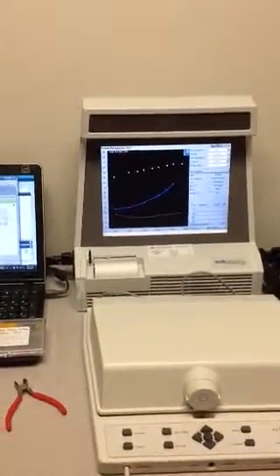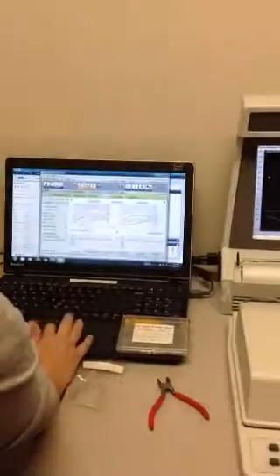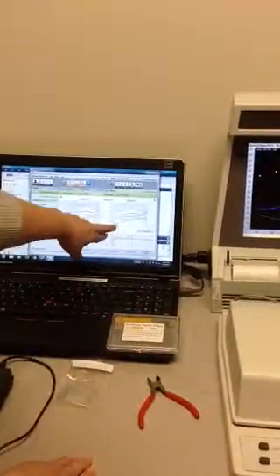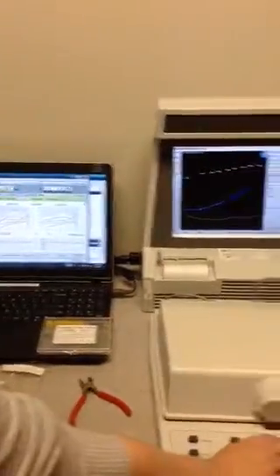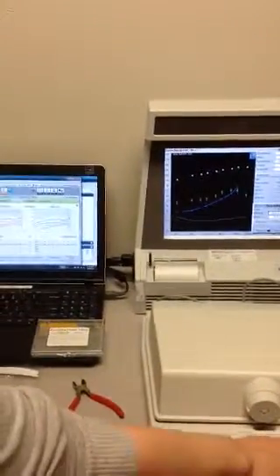Okay, so got ourselves connected here. Alright, so Phonak is assuming that its calculations will match target. So I'm going to run test number 1.